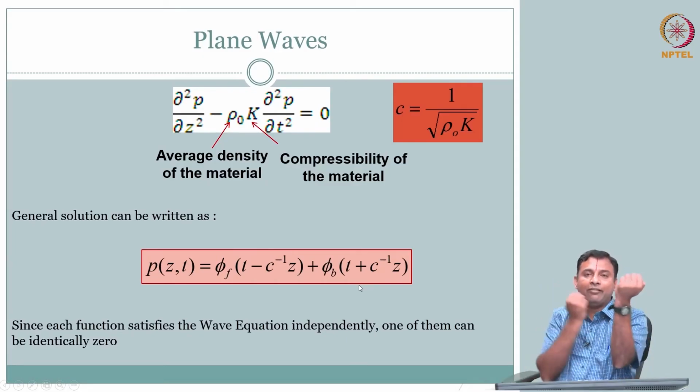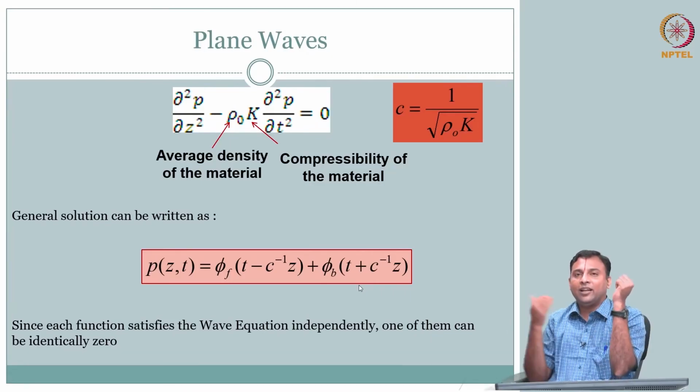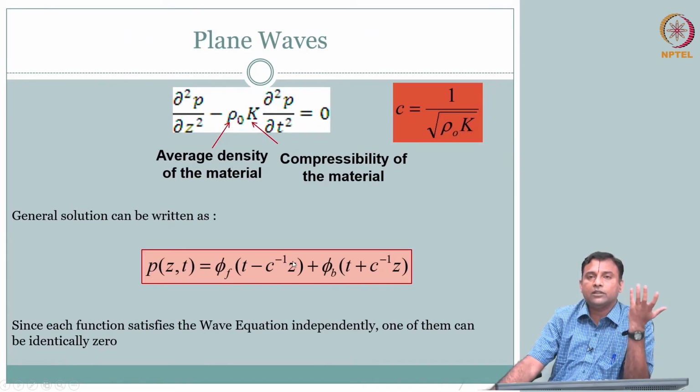We are interested in sending a wave into the tissue. Therefore, we are interested in the wave that is going into the tissue, and it can come back. We are not really interested in how the wave is generated, where one goes into the tissue and one goes to the outside air, or the other direction. So, without losing generality, we can treat only one term here, one general solution of this form. So, what could be an example solution of that form? You could have any form. Anything of this form is a solution.